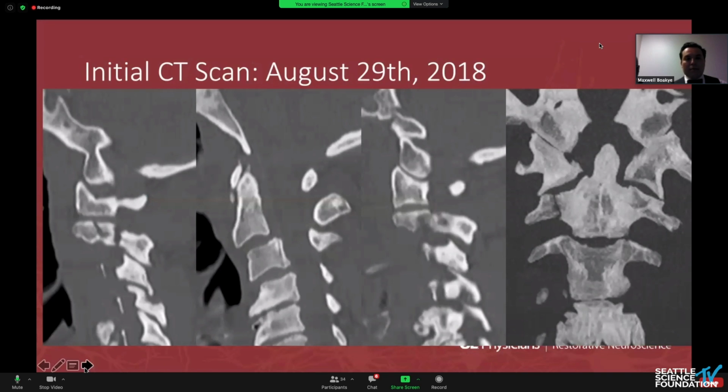Like here, there's a lateral mass fracture of the C2 segment that goes into the C1, C2 joint. So this is a very complex injury mechanism reflective of the complex, unique anatomy of the C2 segment. This is a warning to every clinician that this is not your routine fracture. This is a problem fracture. I think it's great that you got a CTA on this patient because there's clearly a high propensity towards a vascular injury. I'm going to pass the microphone to my partner, Dr. Skuyan, to see what he thinks about the management and going to the occiput. But obviously the C2-3 motion segment here has a significant injury disruption.